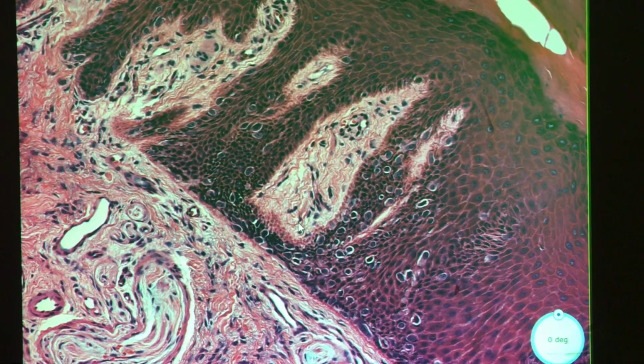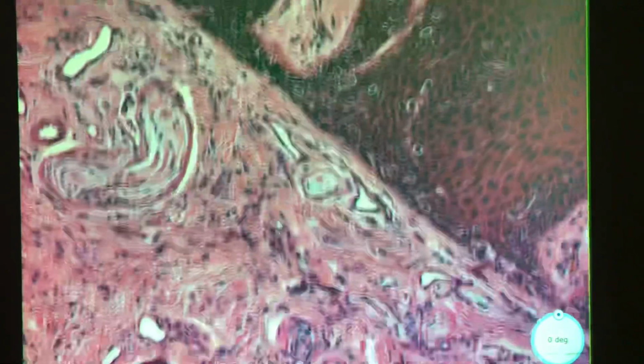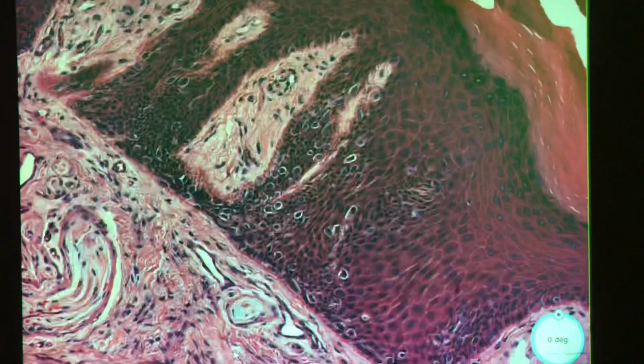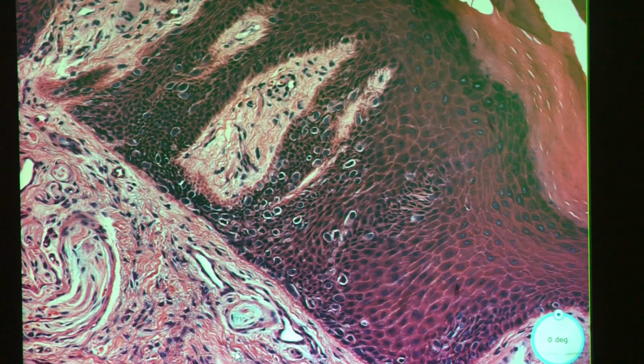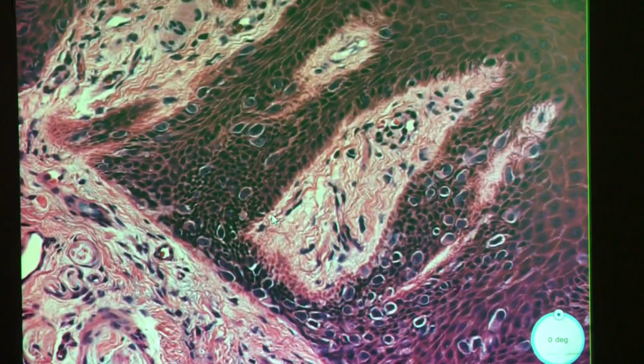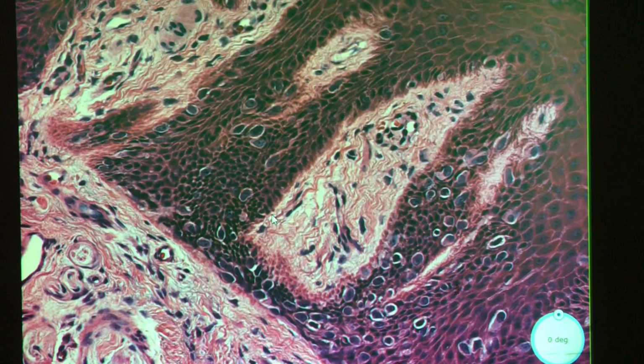Basal, okay. Is it in situ still? Because I'm not seeing anything beyond into the dermis. This is still in situ. So this is honestly probably the best area on the slide. I don't have to torture you too much. This is melanoma in situ, and it's just a different subtype. This is lentigo maligna type.